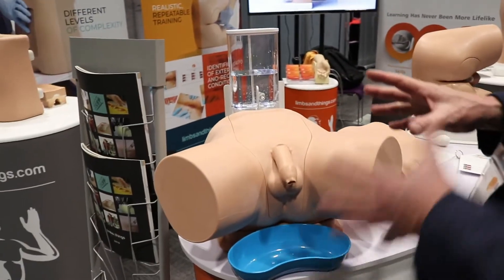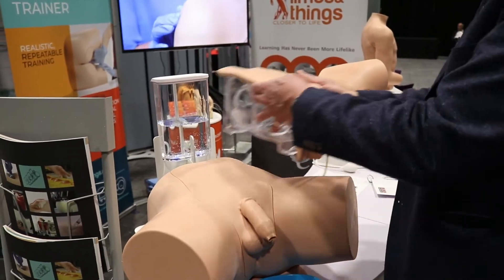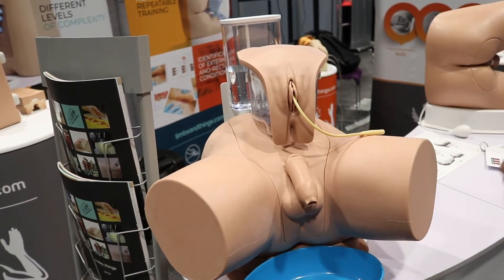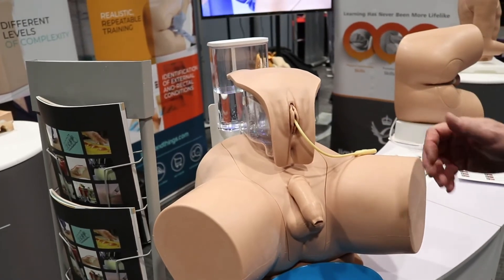A lot of effort has gone into making the genitalia a little bit more realistic on both the male and female. The male has a foreskin, which the old one did too, but it's slightly improved — easier to retract and slightly more durable.